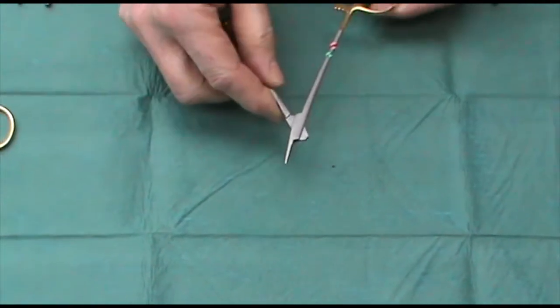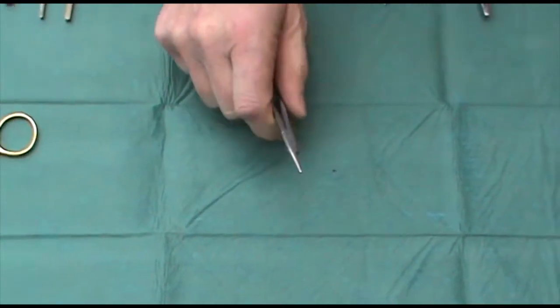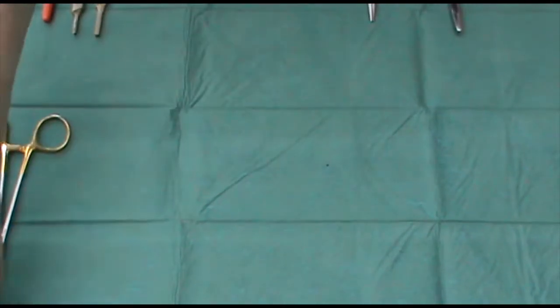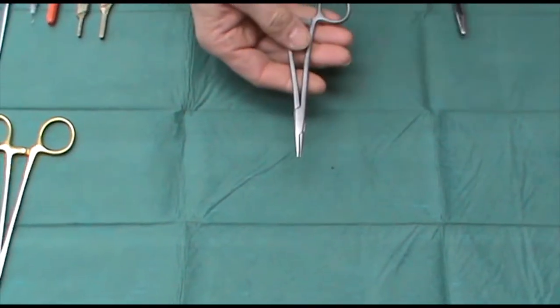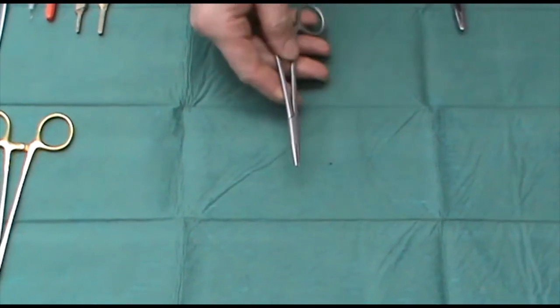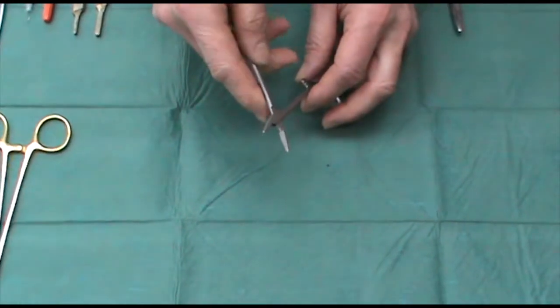Overdo it and you risk doing this, which is neither going to please you nor your patients, because they are a little fragile. On a similar vein is a pair of disposable Crile-Wood needle holders.